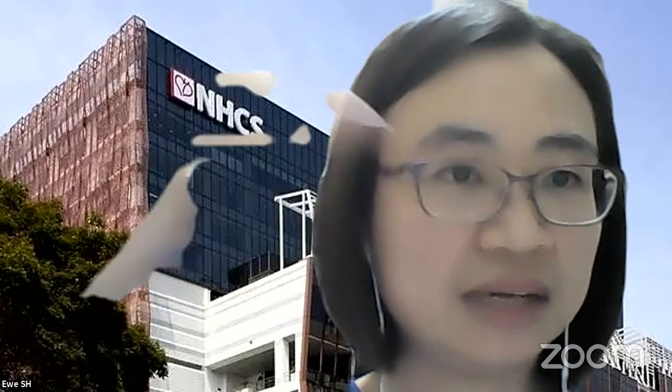The other possibility is eccentric aortic regurgitation, where PISA quantification tends to underestimate on echo. So I do not actually trust PISA quantification on an eccentric jet. If you go on to do CMR, you will find the echo underestimates, because in CMR you can directly measure the forward flow and the leaking flow. I also looked at whether 3D can help with the vena contracta, and it seems to correlate a bit better, certainly better for central AR than for eccentric AR.